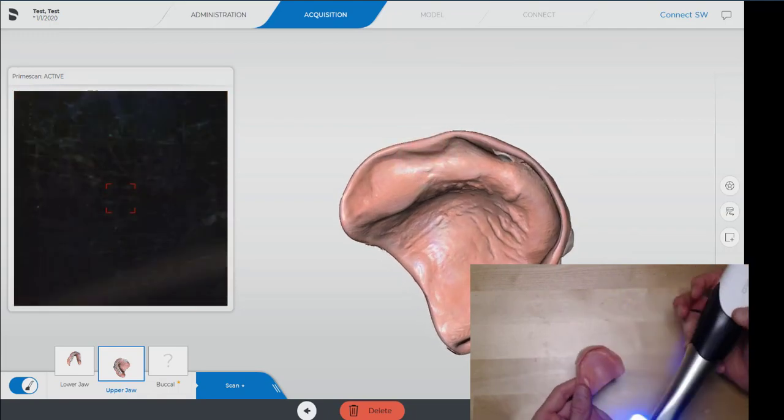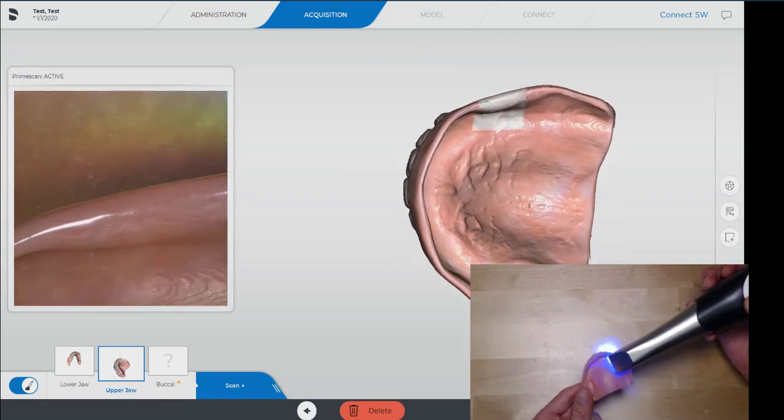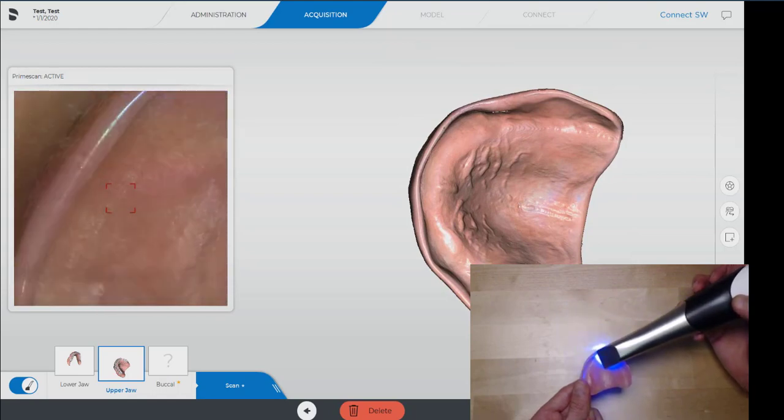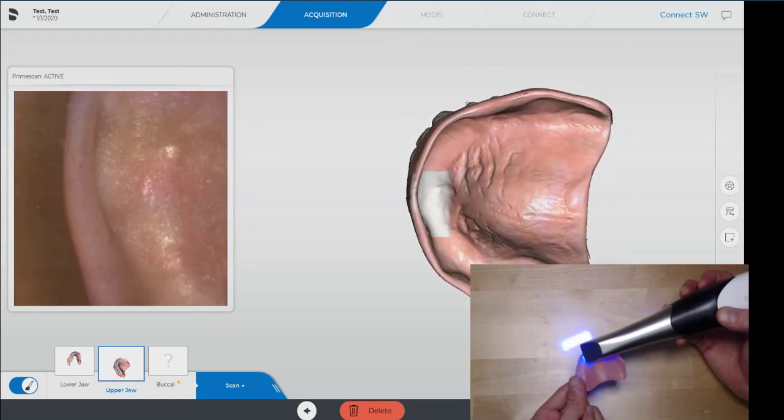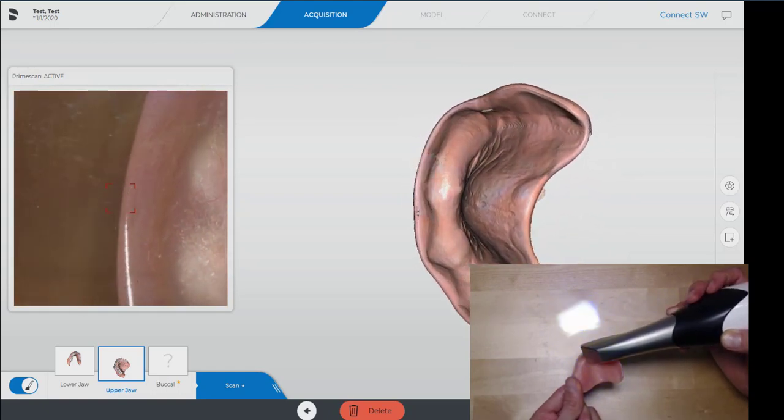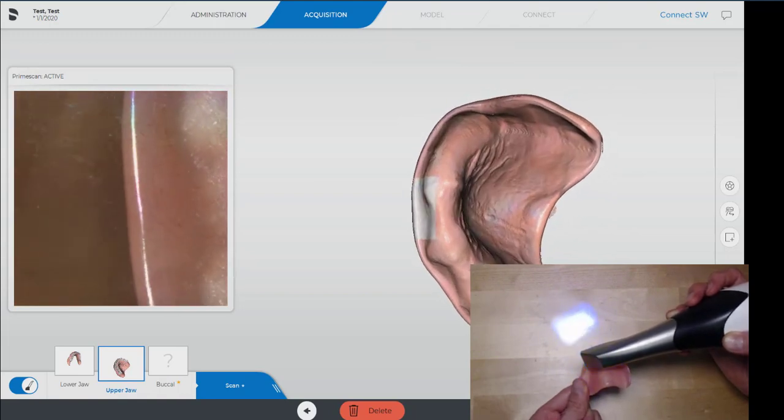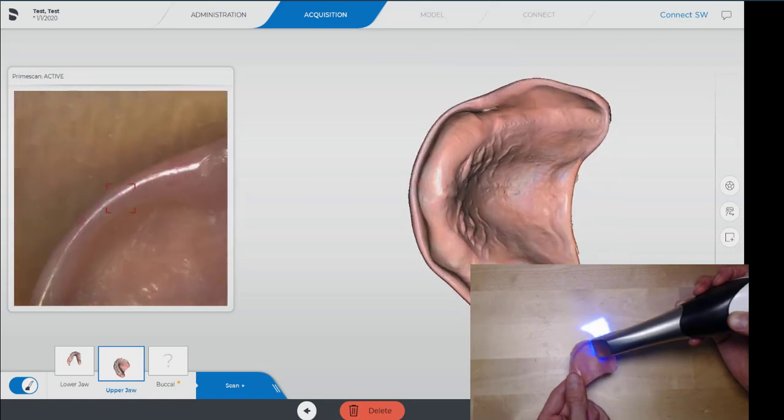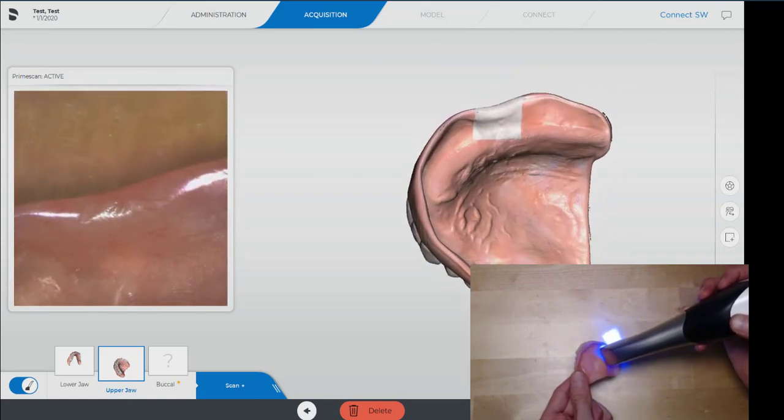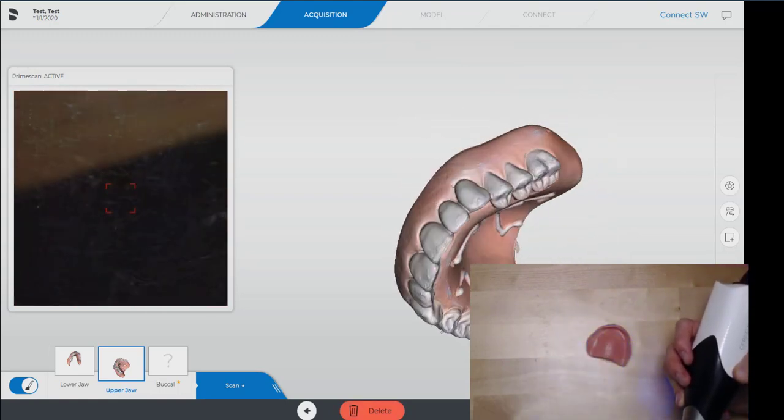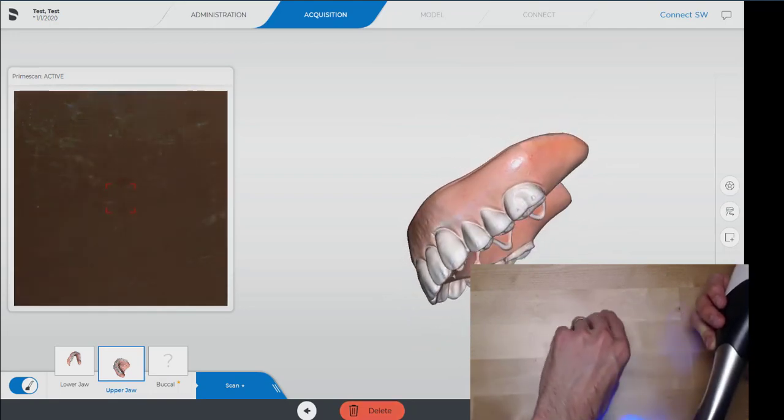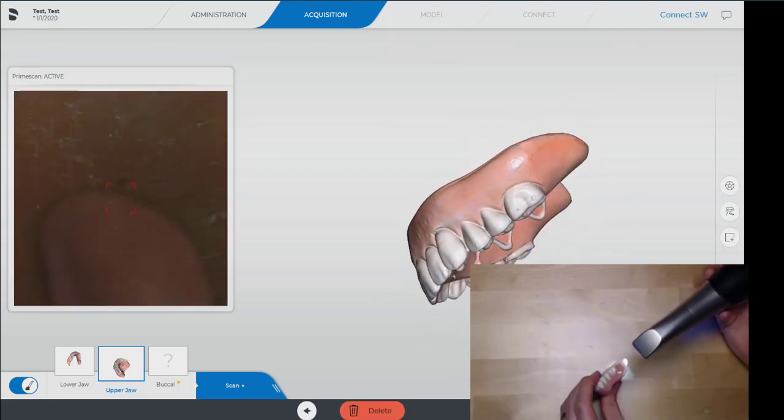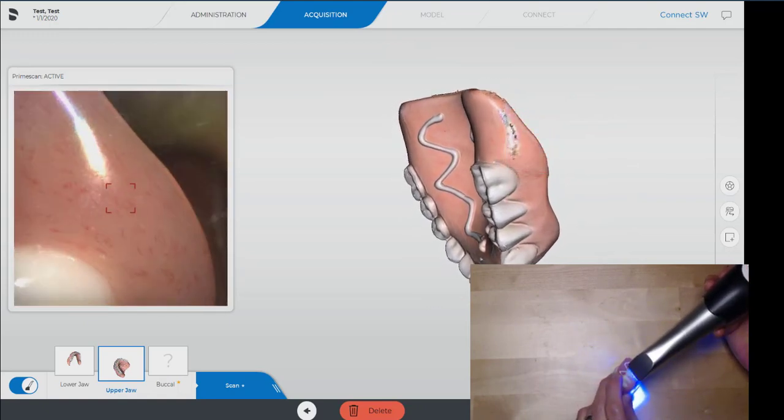Okay, so the only place we're really lacking is right behind the incisors here. There we go, we're just going to rotate up in there. I think that's got us pretty good. Catch this spot. One spot on the left side there. Anytime you can anchor back to the teeth it makes it a whole lot easier.